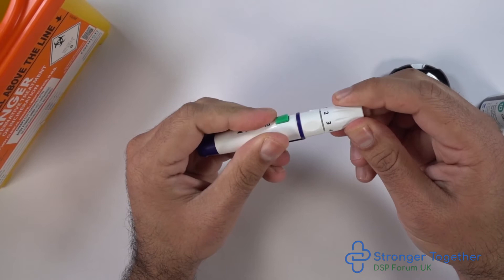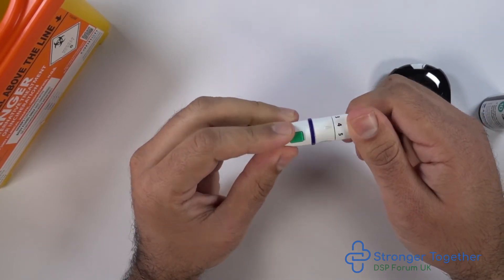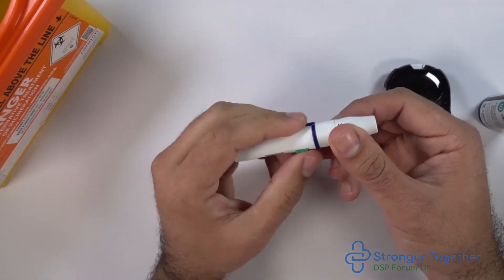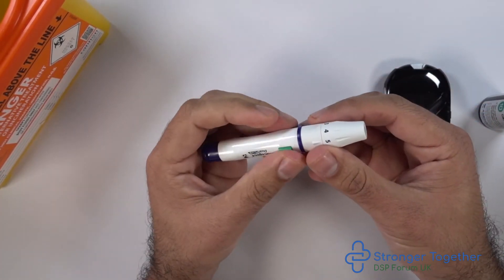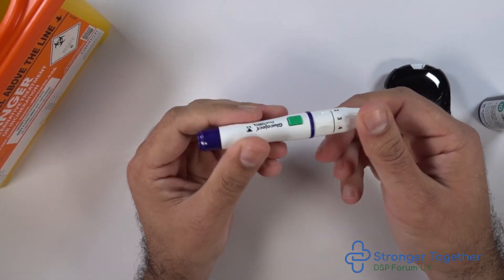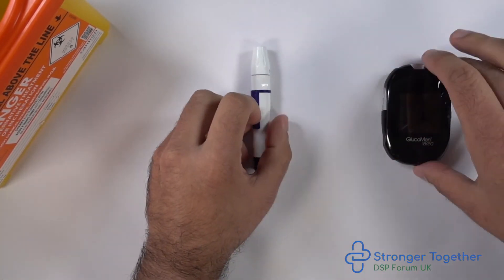We then set the depth of penetration. As you can see there are numbers on the end. You can load your device by pulling back the navy blue plunger on the back of the device. When we press the green button you can hear the discharge of the device. In this instance we've set the depth of penetration to number two.